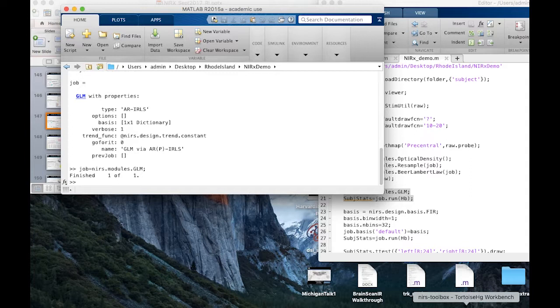It was 90% of the math in my talk that I didn't give this afternoon. The way that this algorithm works is, there are 2 problems with the NIRS data. There's physiology, slow drifts, and you oversample it, which means you get what's called serially correlated error. So you might have 1,000, or in this case, 80, whatever, 100 data points, but you don't have that number of degrees of freedom. You have far less because your measurements were not independent, right? And that's what's called serial correlations.